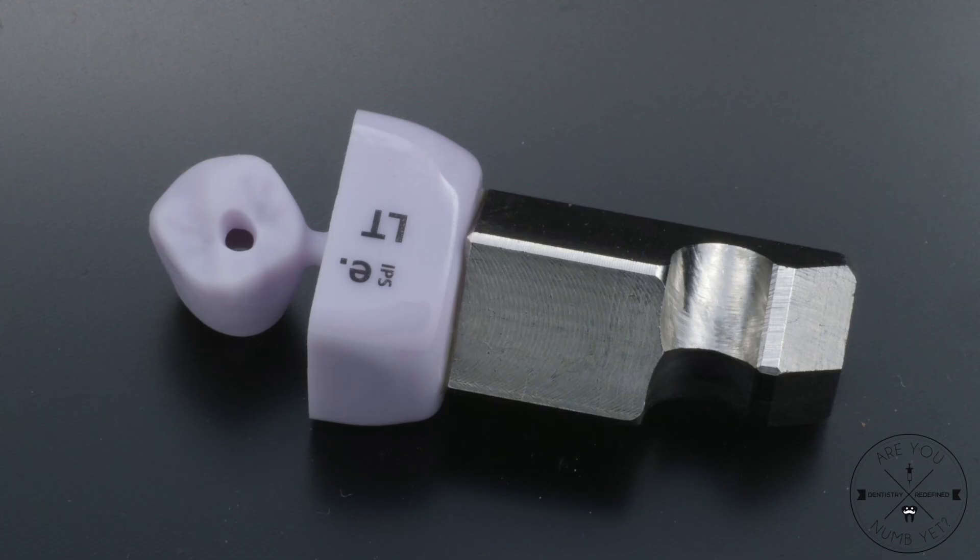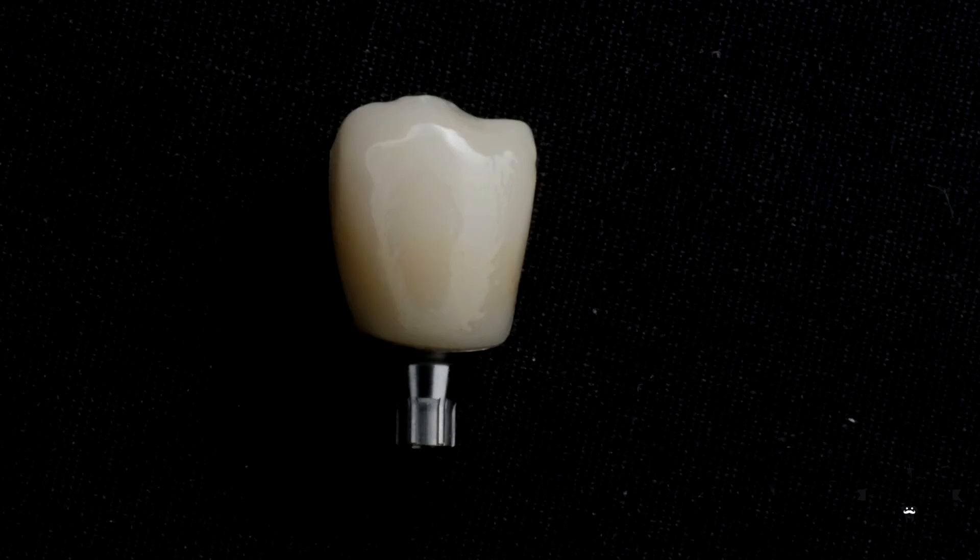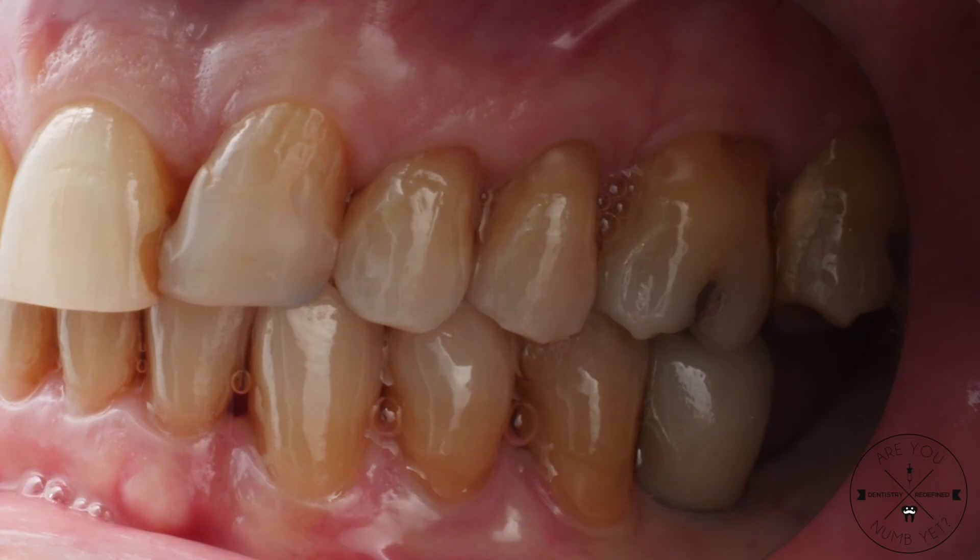Then you're going to get that out and it is going to mill with the hole in it. You might have a tiny little bit of flash that you need to remove, but it's pretty much ready to go. Then you're just going to fire it and bond it onto the abutment, custom abutment. These types of workflows, these kind of screwmentable workflows, we're going to talk about a lot at the course. So I look forward to seeing you guys there.